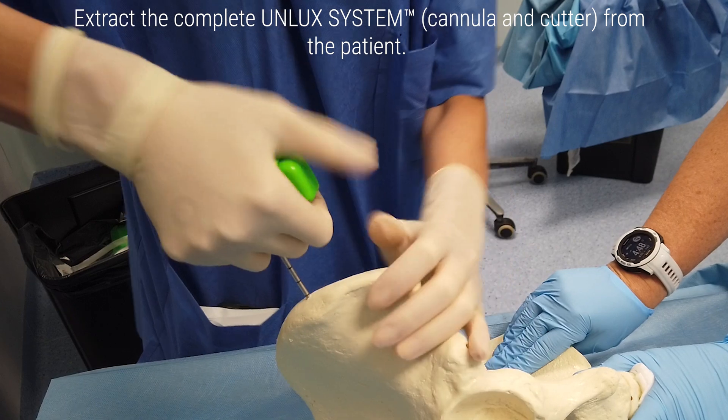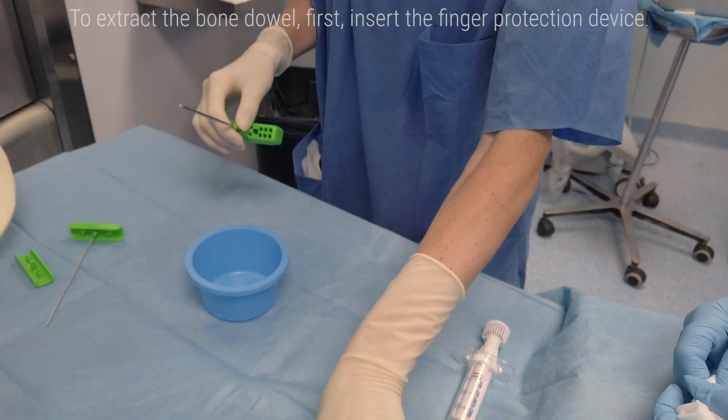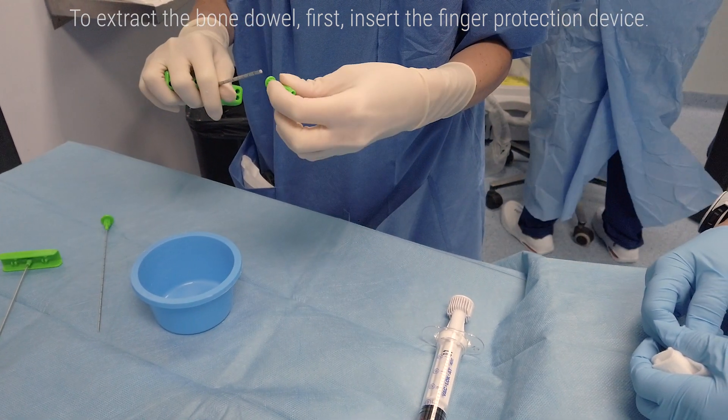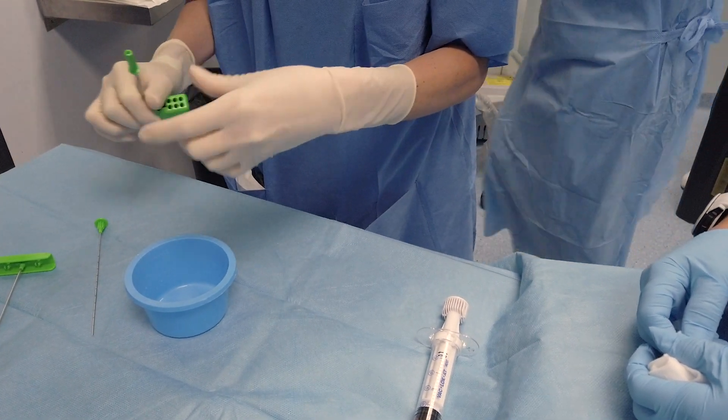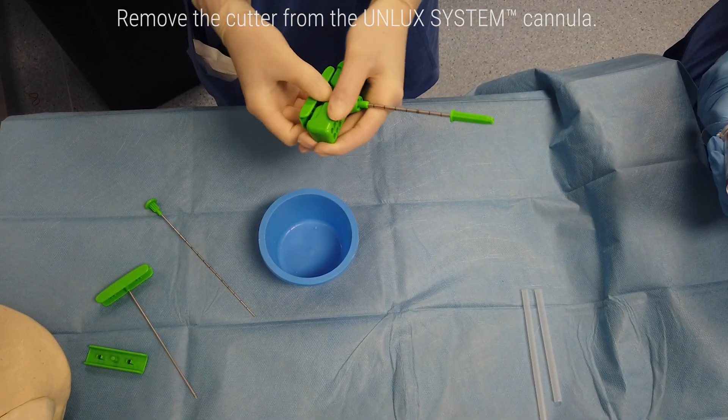Extract the complete Unlux system cannula and cutter from the patient. To extract the bone dowel, first insert the finger protection device. Then remove the cutter from the Unlux system cannula.